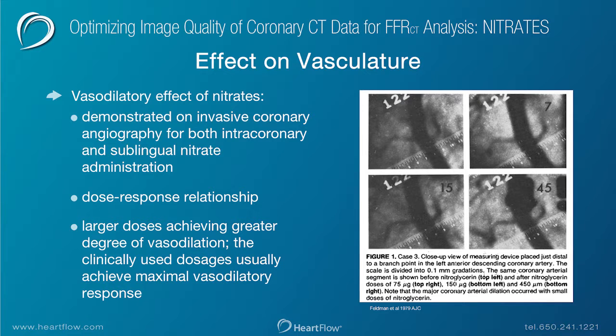This anecdote I showed you is well established both in the mechanism of nitrate-mediated vasodilation, but also going back historically into the angiographic literature. Here are examples from the historical literature dating back to 1979 from Dr. Feldman's paper in the American Journal of Cardiology. We can see the vasodilatory effects in a similar fashion, in this case on invasive angiography. What we see here is both intracoronary and sublingual nitrate administration results in significant enlargement in the coronary arteries.